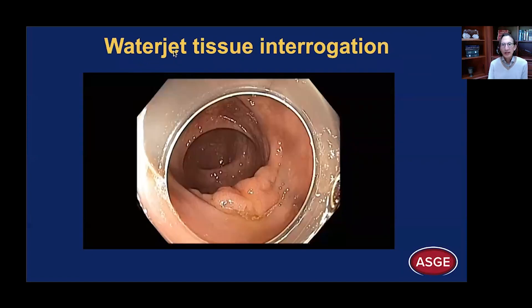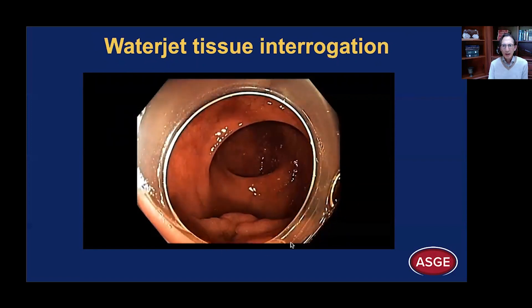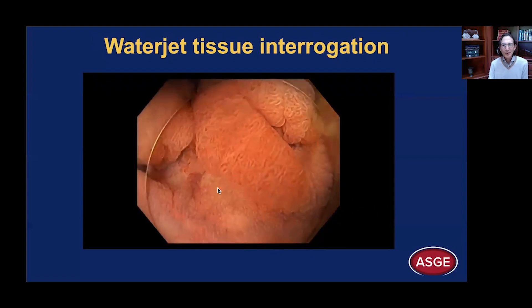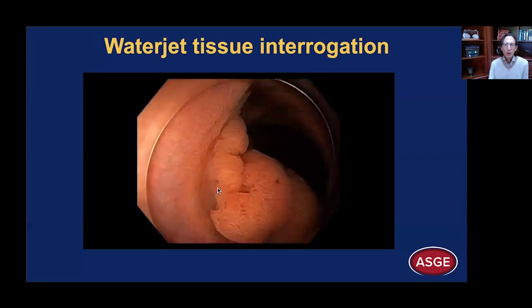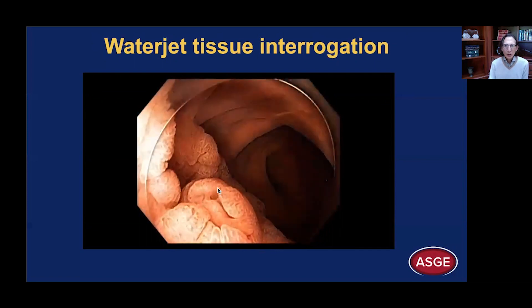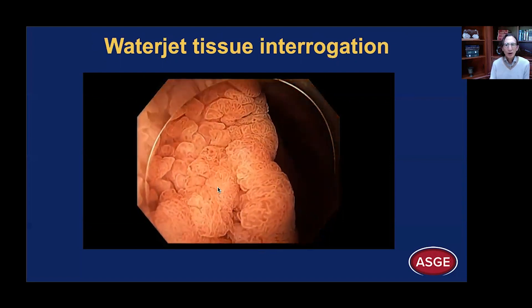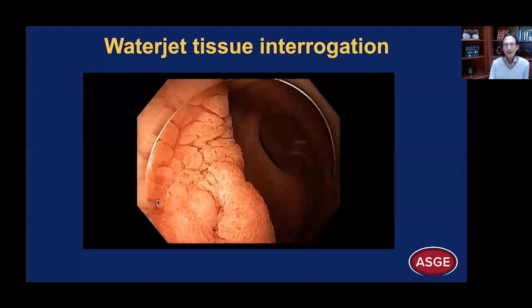We can also use the water jet to interrogate tissue. Here you can see a polyp growing along a fold and extending more proximally. It floats into the lumen after water submersion, and we are interfacing with this lesion using the water jet to move the villus components around and look in the valleys between the hills of the villi. This can be very helpful to identify pathology, especially in a depressed lesion.